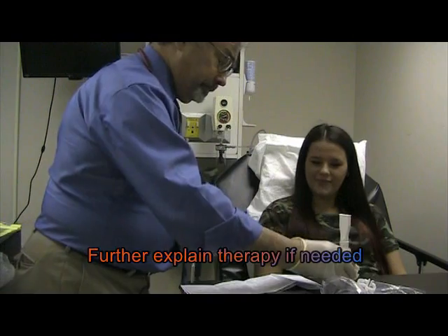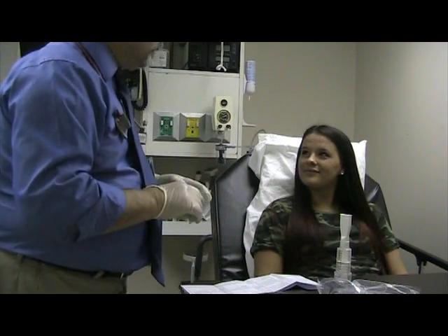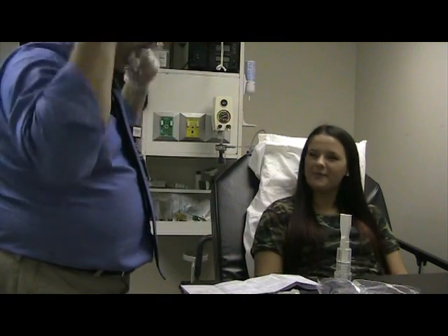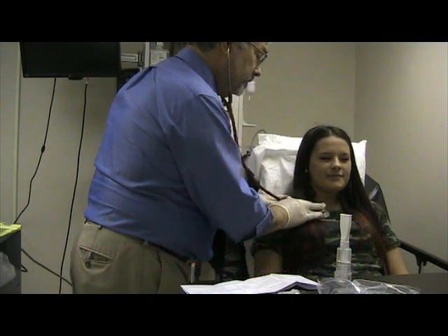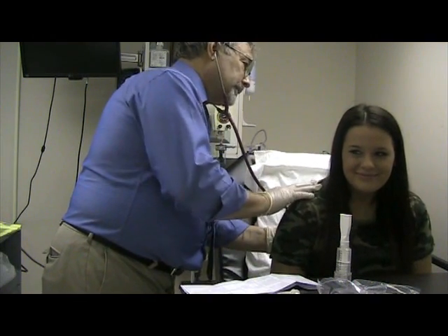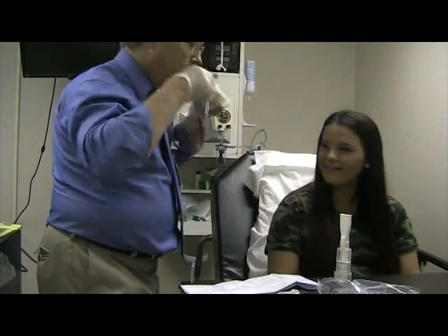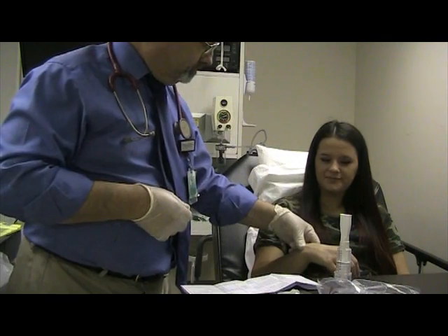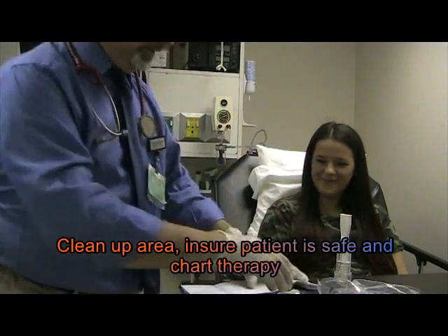I'm going to leave this here with you. You are doing fine — you don't need the nose clips. You seem to be very capable of not breathing out your nose. Any questions? Nope. I need to take another listen to your lungs. Oh yes, much better — I can hear breath sounds down in the bases now. Take your pulse. Thank you very much. Have a good day.